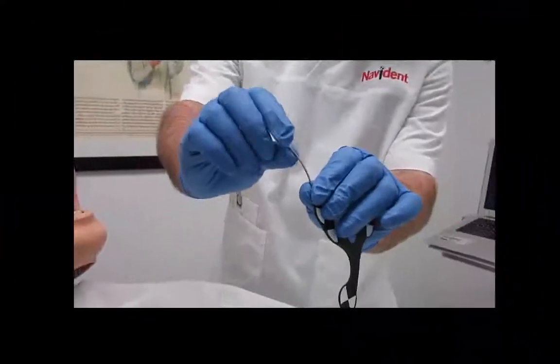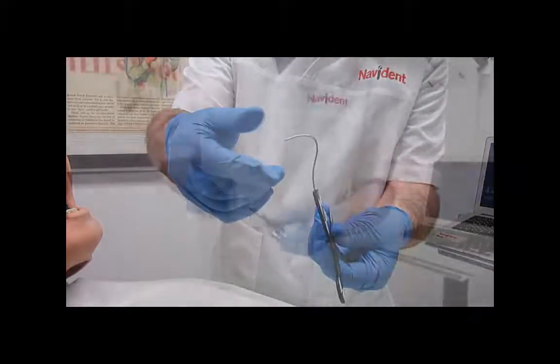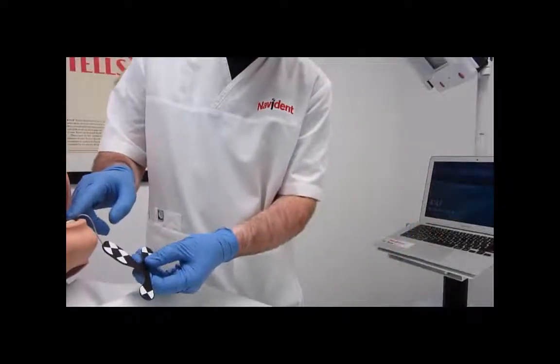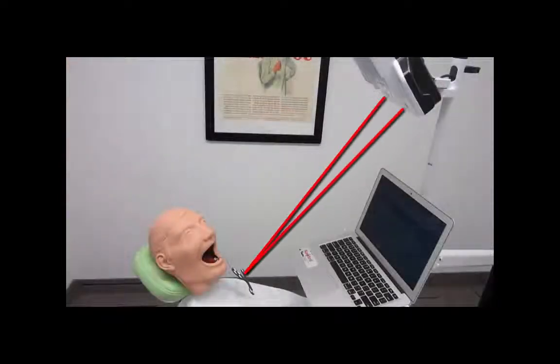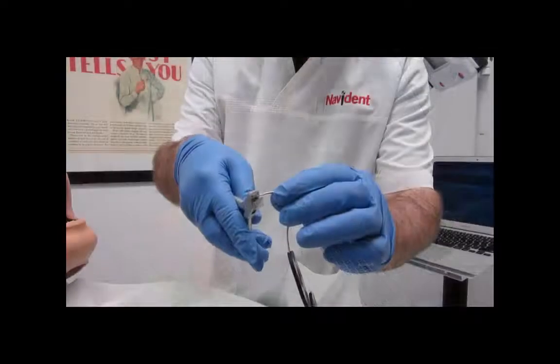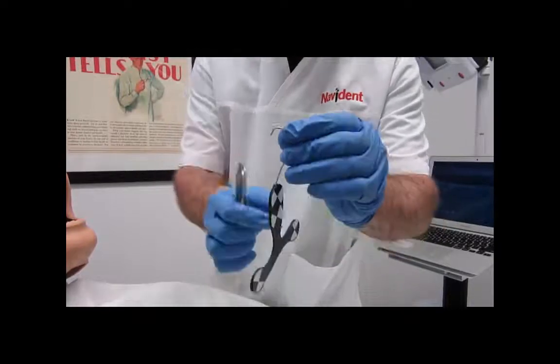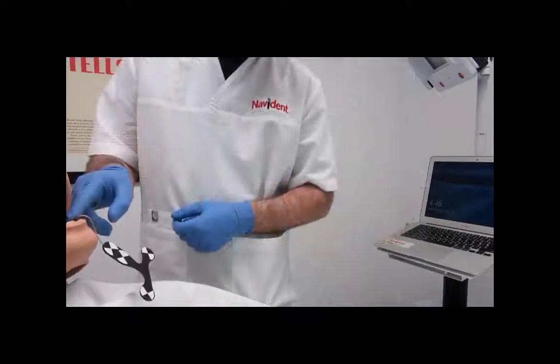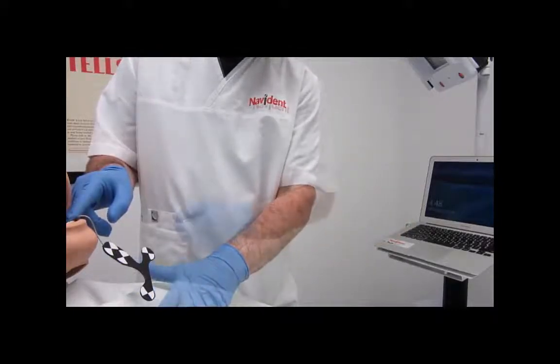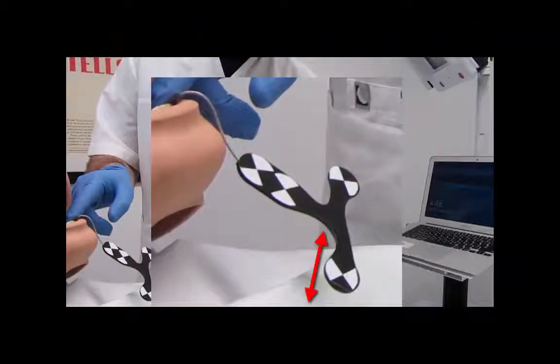First, the wire needs to be bent into the right shape to position the tracker so it will face the camera and will minimally interfere with the motions of the surgeon and the assistant. We also want to minimize potential camera's line of sight interruptions. Using the bird beak pliers, the last 5 to 6 millimeters of the wire are bent for the attachment to the tooth on its lingual side. By default, the tracker should be placed at the front, with a clearance of at least 1 inch above the patient's chest to avoid bumping into it.